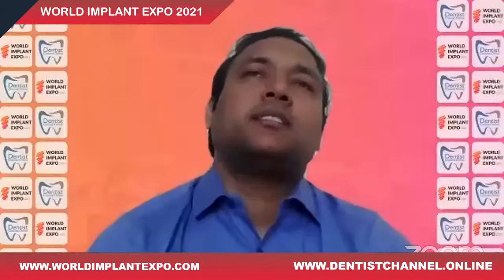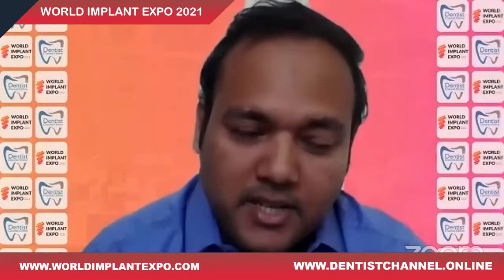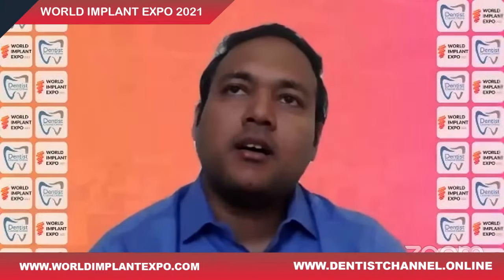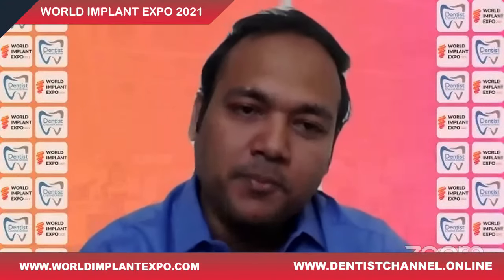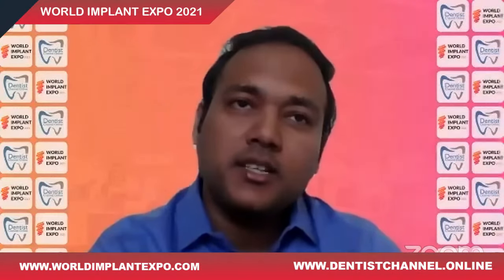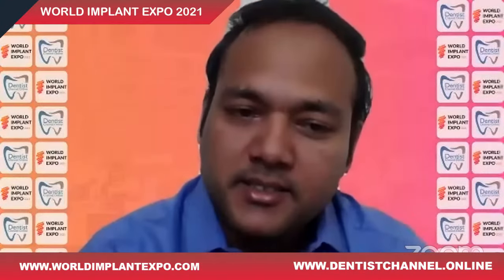Well, in one of my slides I've mentioned that the problem with CBCT is mainly the soft tissue resolution. We are going to depend upon the CBCT only for the hard tissue and not the soft tissue. So when it is soft tissue projection, all that I could understand is the adjacent soft tissue that needs to be concerned.